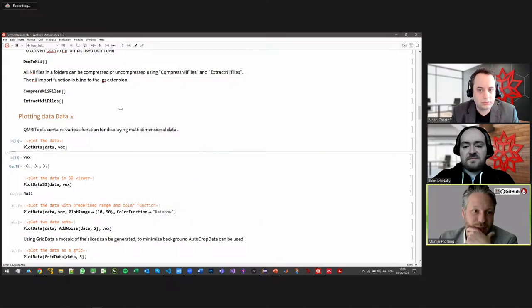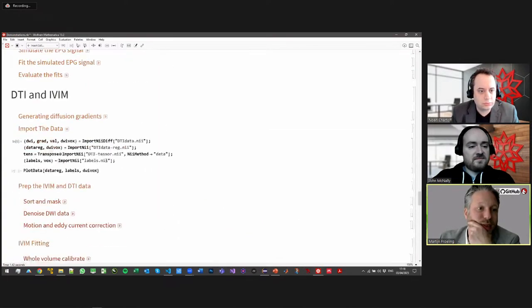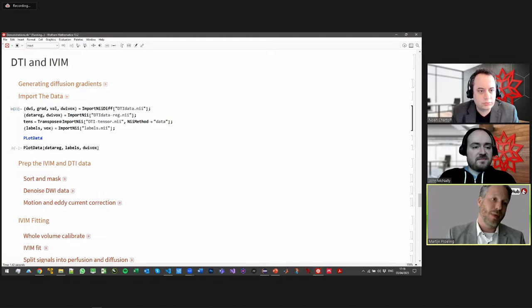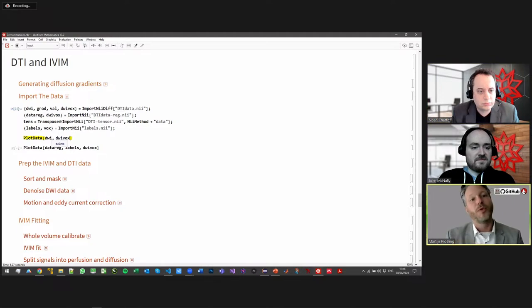Yeah. And then let me see if I can get to a different data set. Let's do this. So if we look at this full data set, this was one volume of this data set. And now I'm looking at all volumes. So we actually do multiple directions of this data. Directions is the wrong word.